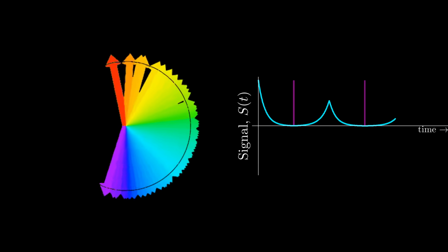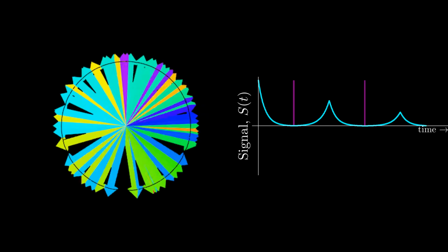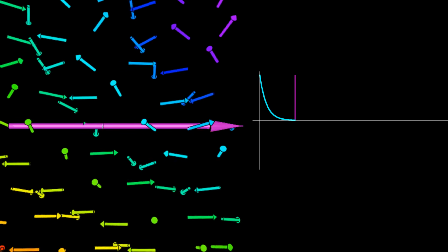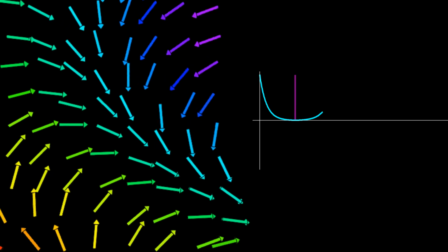Notice that after the 180, the spins continue to precess at a rate dictated by their field strength and represented by their color. Purples in the low field are always precessing counterclockwise. Reds always clockwise. The 180-degree pulse doesn't change where the spins are in space, and so does not change their precession frequency. Perhaps this is easier to see if we look at the animation of the spins unstacked. If you want, you can focus on an individual spin to verify that its precession frequency does not change following excitation. The spins dephase, then following the 180, they rephase into a peak and then continue to dephase.